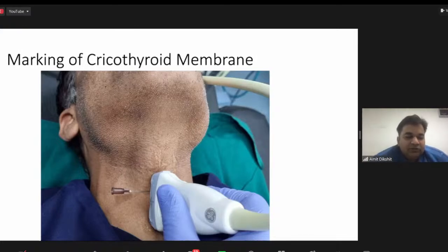It is very difficult to conduct these intubation drills in sitting position. And for some oxygenation, we also have to maintain that 16 gauge cannula in a straight position. Sometimes the patient tends to cough and a lot of secretions come through the cannula, so it is difficult to oxygenate. But in that case, a little bit of spraying has helped and we could still maintain some amount of oxygenation before going ahead with the drill.